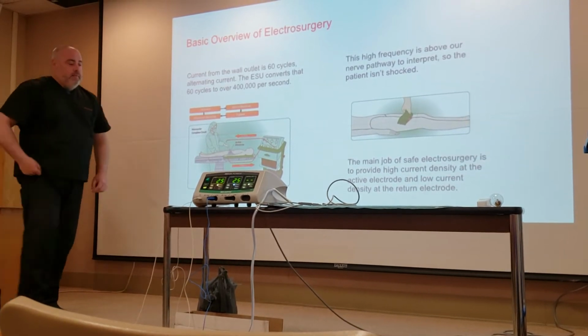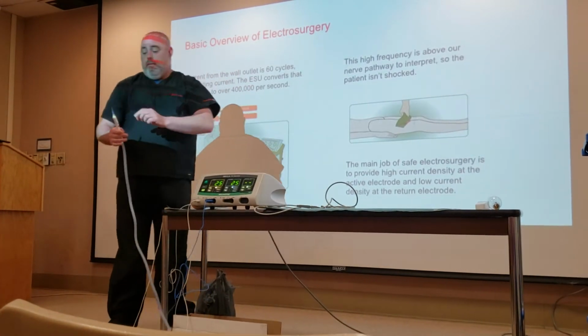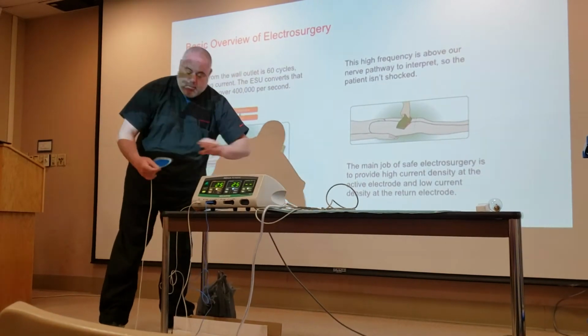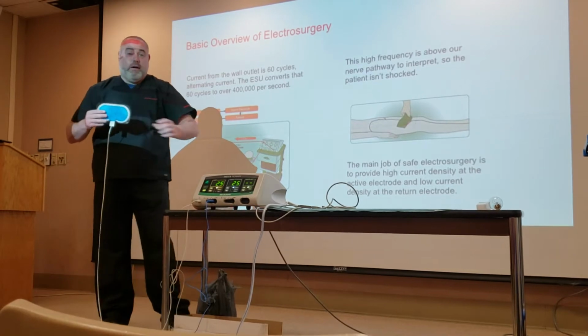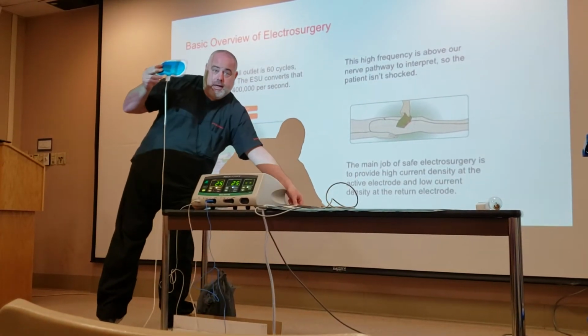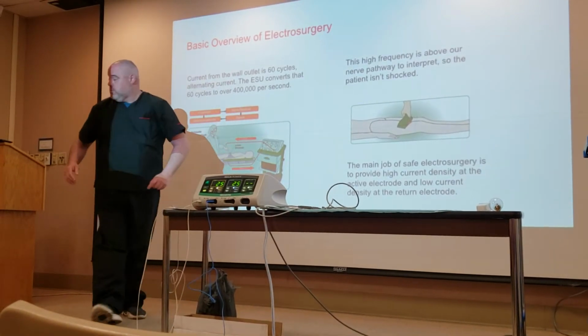But the main job is to take energy at a high current density at the tip of this blade and disperse it over a wider area here. That's why this has surface area. Current concentration here, dispersing it on a pad here. And we'll talk about these pads shortly.